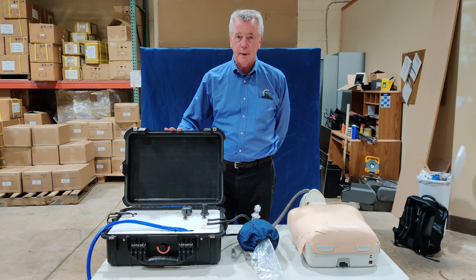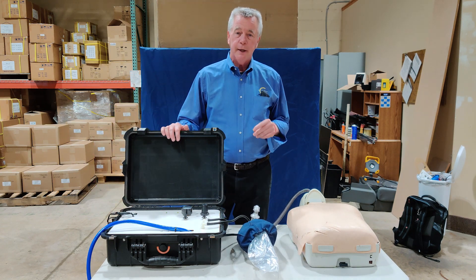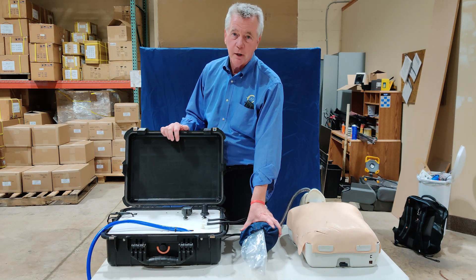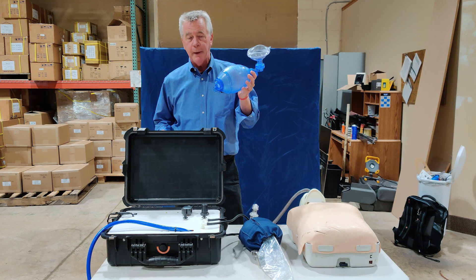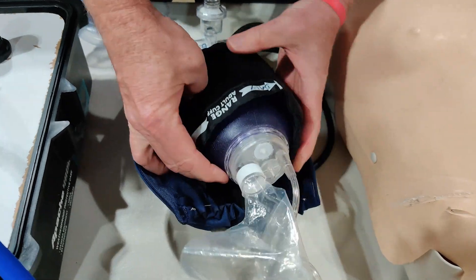This is our first prototype here. I'll turn it on. The basic idea behind it is it takes compressed air and valves in here, and we take a blood pressure cuff and put it around a normal bag valve mask. We can constrain it from the outside so it cannot stretch too much, and the force pushes on the bag.